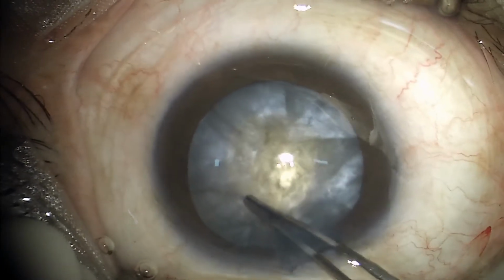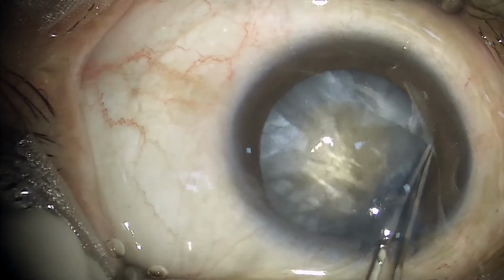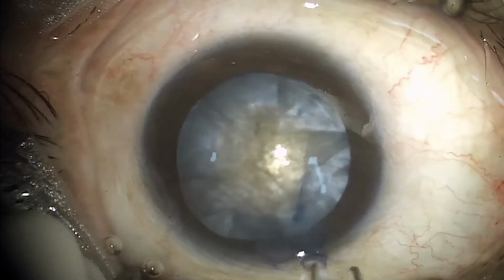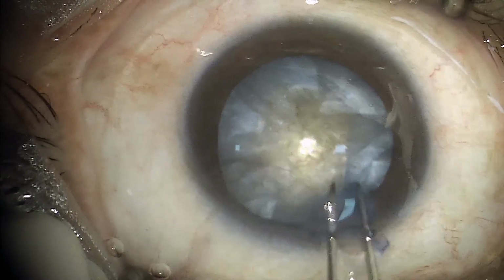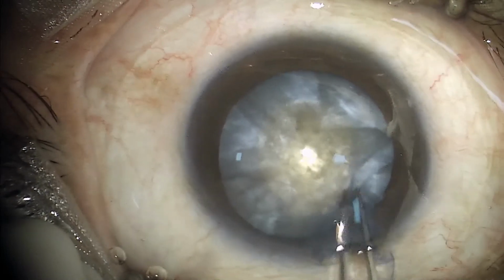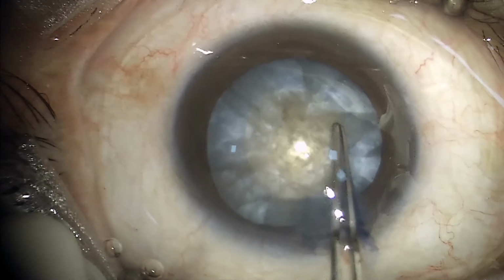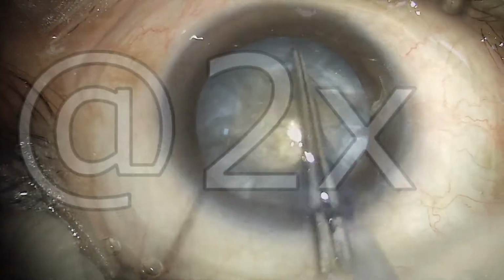It is possible in particular angles that the forceps has difficulty grasping the end of the capsule, so one has to maneuver and make sure that the capsular tag is gripped properly so that the rhexis doesn't extend out.